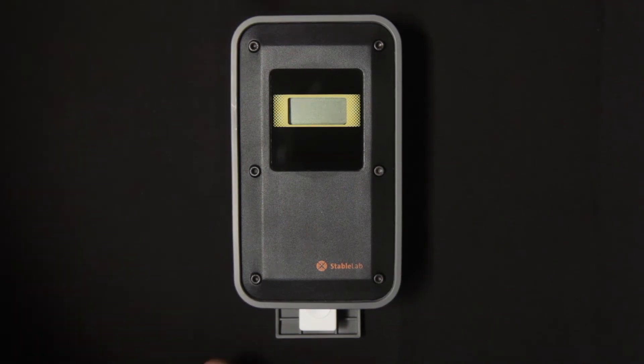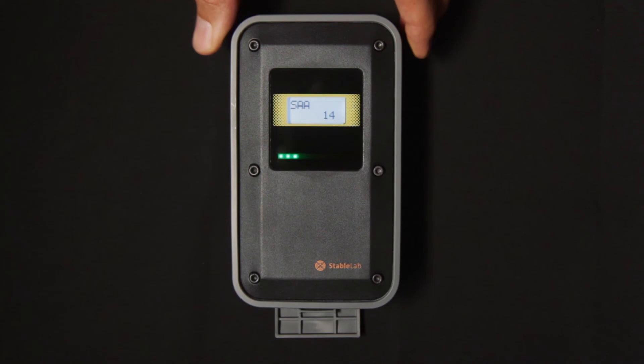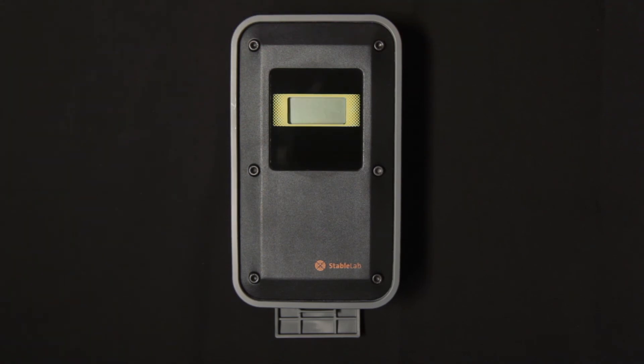You can literally leave it for a number of hours, come back, remove the cartridge, and the result will have been stored. It will flash back up on the screen again for 10 seconds.